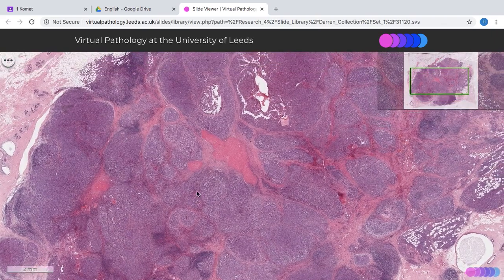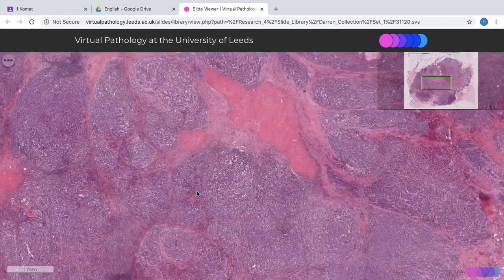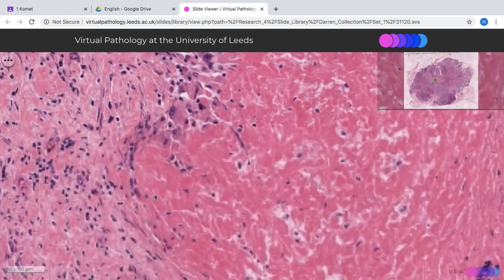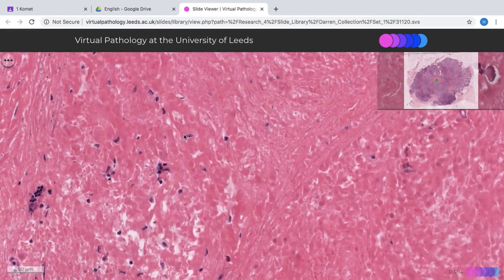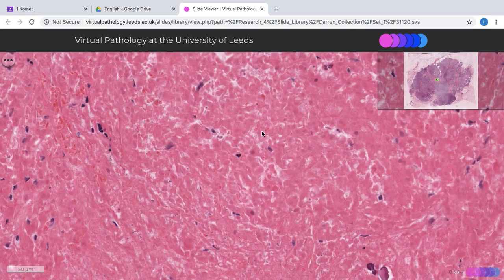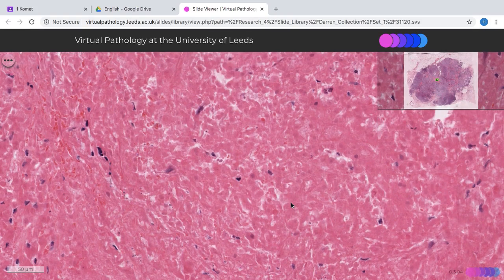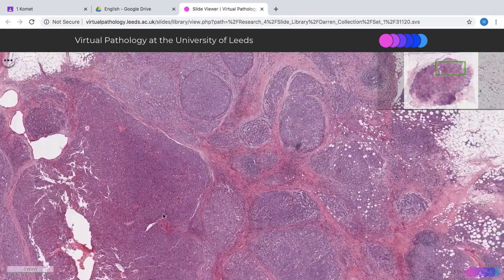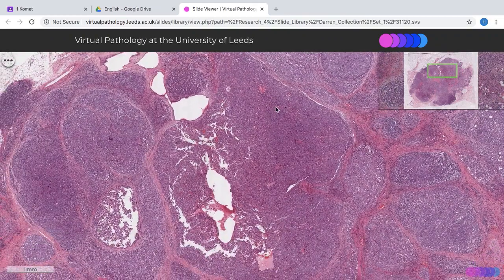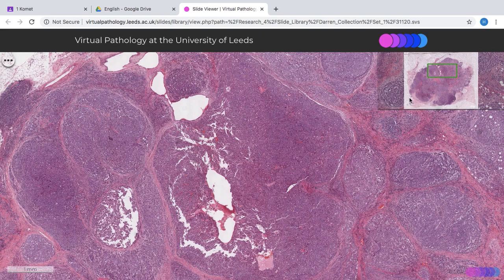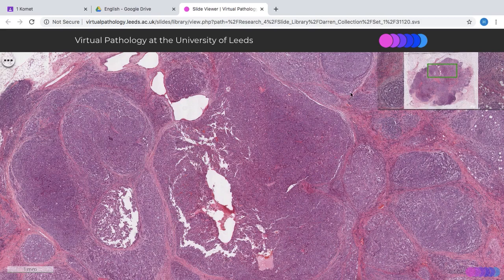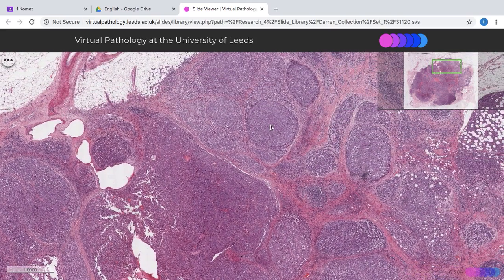That is the basic approach to reporting invasive carcinoma of the breast. An additional finding here is a central area of necrosis — you can see cellular ghost outlines present but lacking nuclei, which is some sort of coagulative necrosis, probably due to the large size and therefore lack of vascular supply and subsequent cell death. Other things to do when reporting include measuring the size of the tumor, usually done grossly but also microscopically in small tumors, as this contributes to TNM staging. You should also identify the presence of in situ carcinoma such as DCIS and grade it low, medium, or high grade — though it's not present in this particular case.